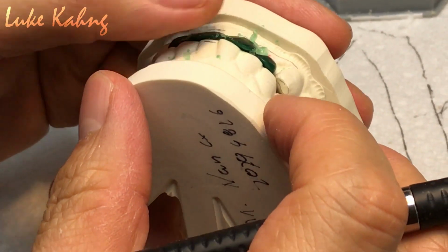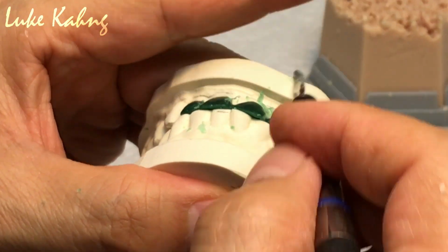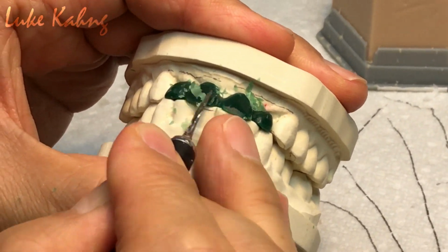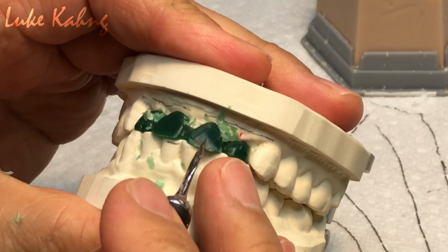So I have to make this. Right now the bite is good. I'm trying to bring in a little bit, and protrusion is good. There's no stock, so it itself has freedom, which is good. Then I can grind a little bit more, like that. Much thinner, right? Yeah, much thinner.